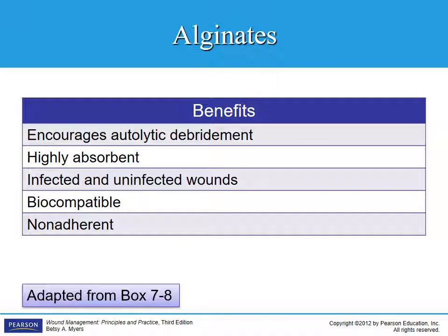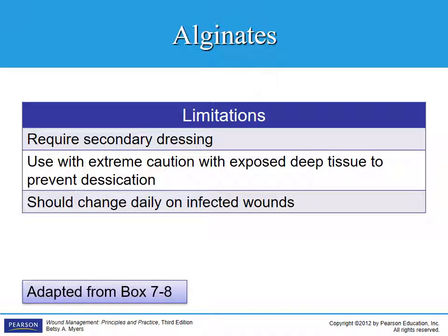Benefits: it encourages autolytic debridement. It's highly absorptive. You can use it in infected and uninfected wounds. It is biocompatible in that it will absorb those endogenous enzymes and allow them to sit right next to the wound bed. So the growth factors and the enzymes promote healing. And it is non-adherent. It will not adhere to the wound bed. It does require a secondary dressing.